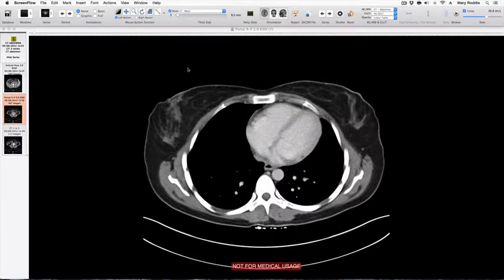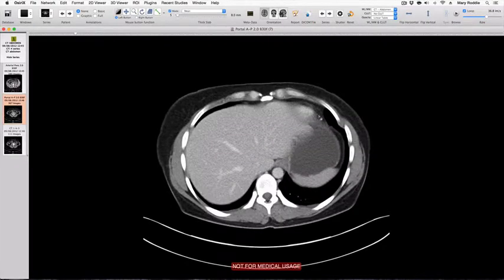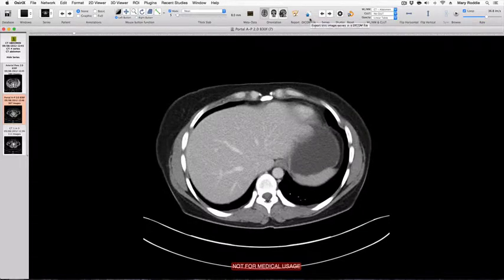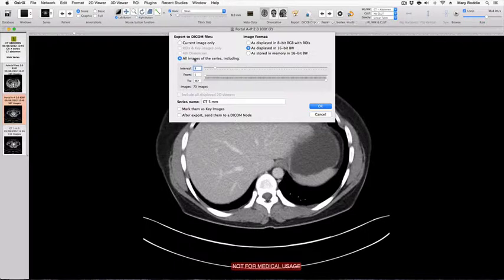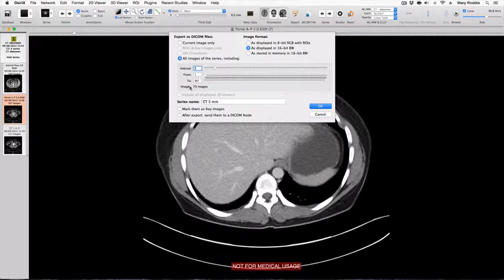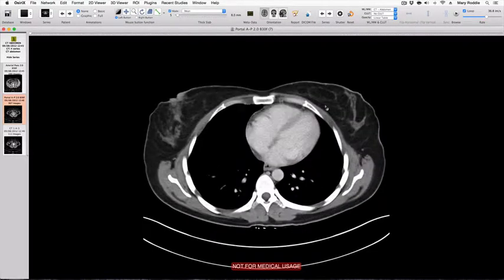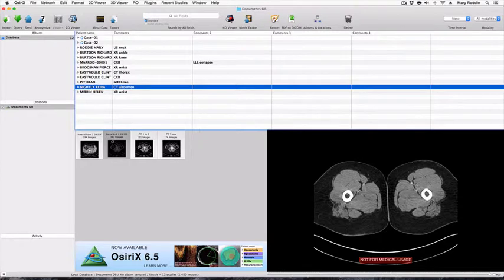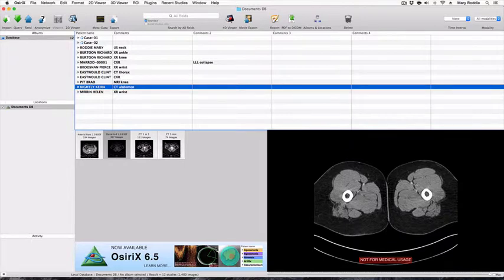If you select that you can then change your slice thickness and in this case it has defaulted to a slice thickness of 5. We can now export this new series of 5mm sections by using the Export to DICOM button, selecting all images of the series and you can see that the new series contains only 73 images. So when we look back at the database now we have three series: the original series with 367 images, the second series where we exported 1 in 3 images which has a total size of 111 images, and a series where we thickened up the slice thickness to 5mm where we have a series of 74 images.